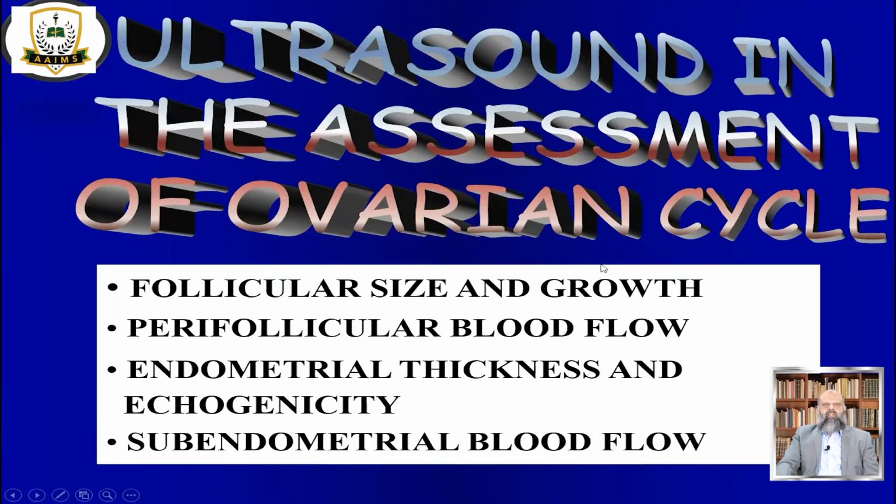Ultrasound in the assessment of the ovarian cycle. It's very important to assess the ovarian cycle. The follicle size and growth is assessed. Then the perifollicular blood flow, endometrial thickness and echogenicity. And then we look at the subendometrial blood flow.